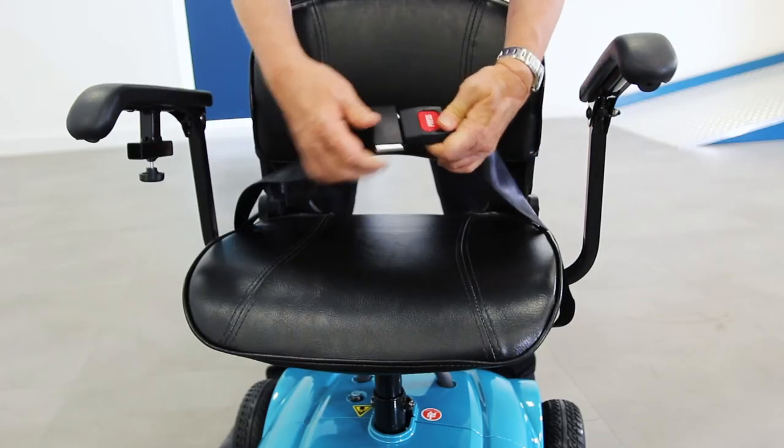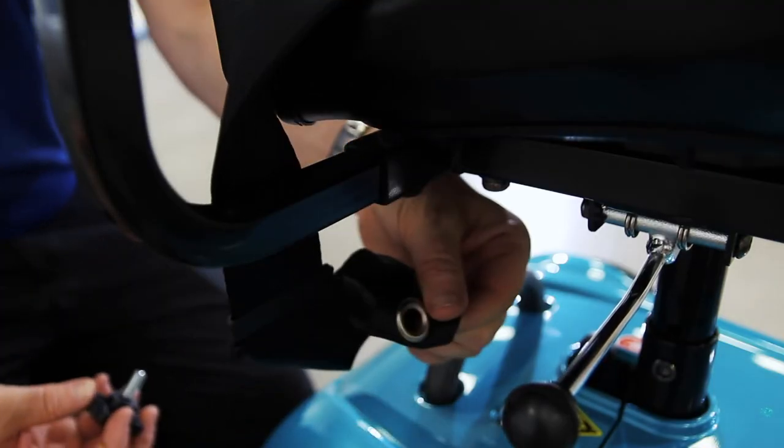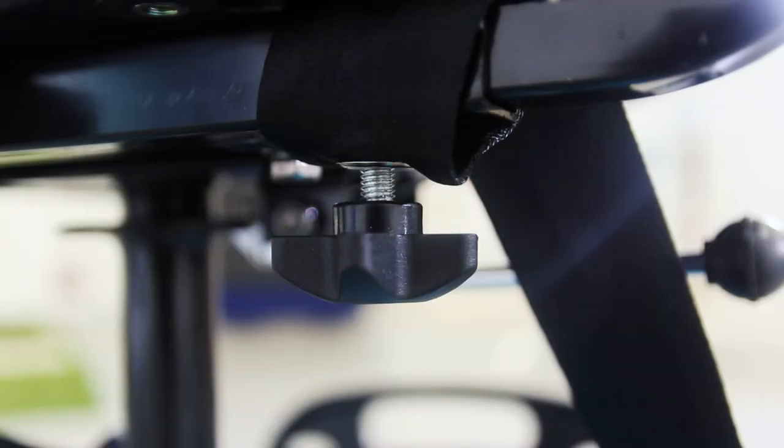The Fenix comes with a seat belt for added safety. To attach this to the seat, simply feed it through the armrests, which can be disconnected from the seat by undoing and removing the knobs underneath.